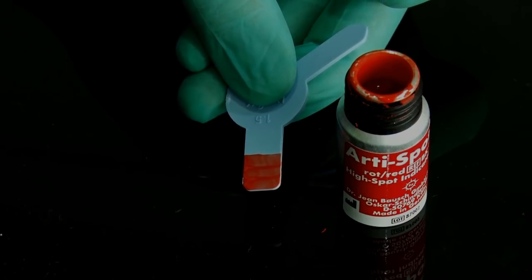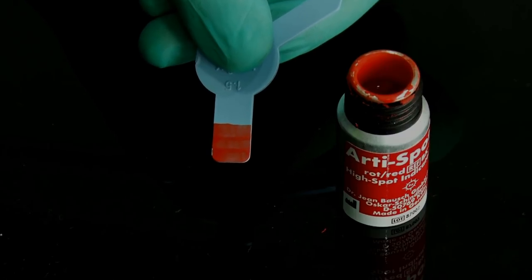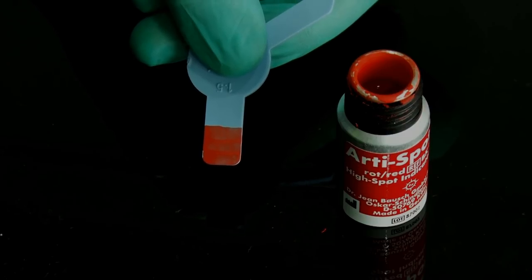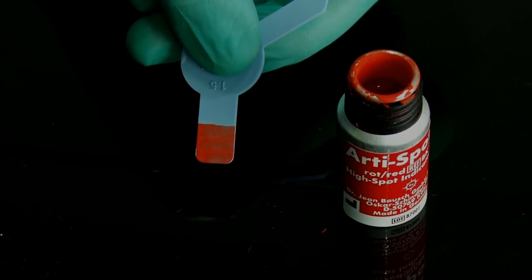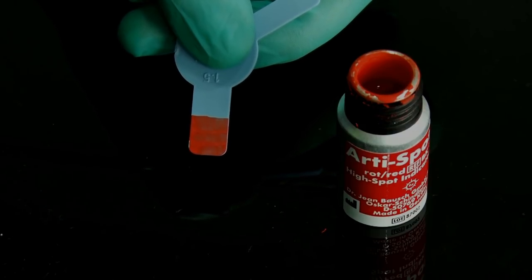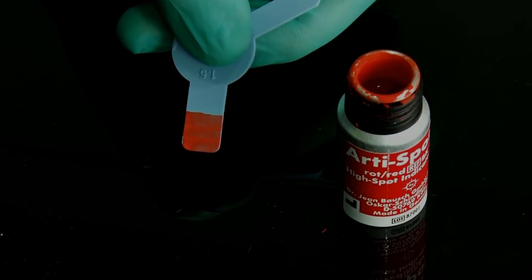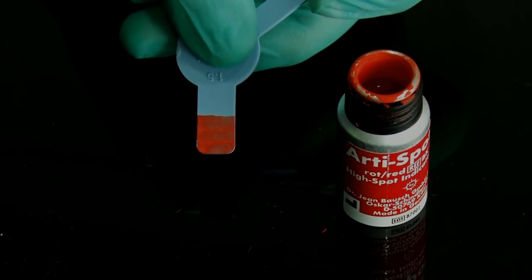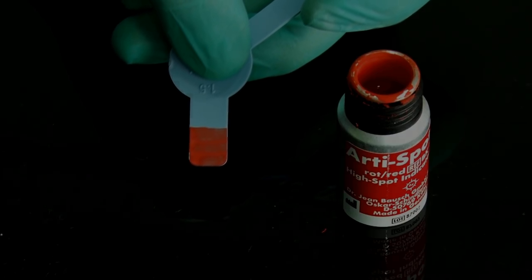Once it is dry, have the patient bite down and — most importantly — make all excursive movements: forward, back, right lateral, and left lateral. This will selectively tell you the amount of further reduction needed during dynamic mandibular movement, not just static. Wherever reduction is less, the paint from the gauge is lost and transferred onto the biting surface of the tooth — wherever it marks selectively, you reduce those areas. This means you will never have a high point due to lack of clearance, and you add quality and predictability to your work.